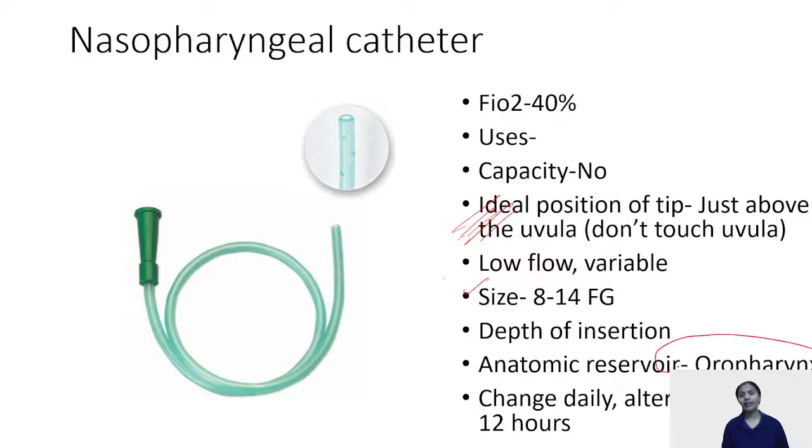Oropharynx. The side effects remain the same as nasal cannula. The catheter has to be changed daily, and you can alternate between the nostrils, first left, then right, every 8 to 12 hours. Sorry, it has no capacity.